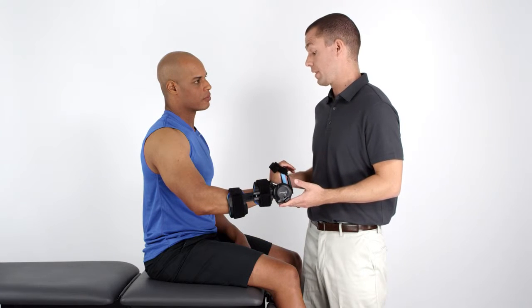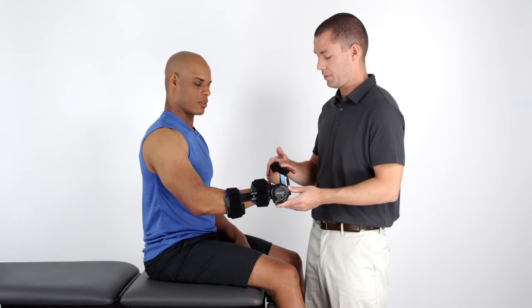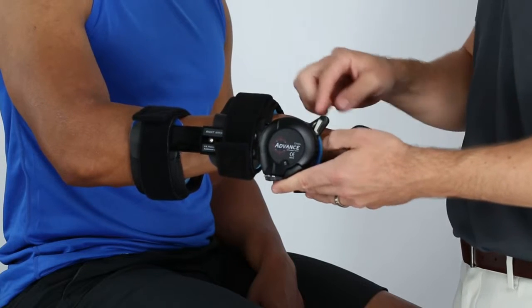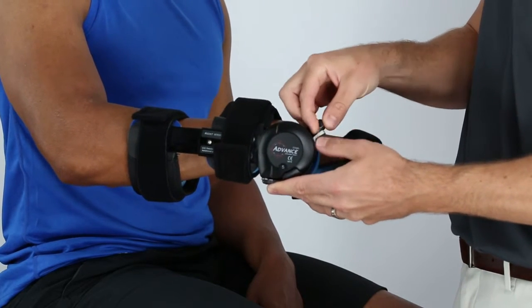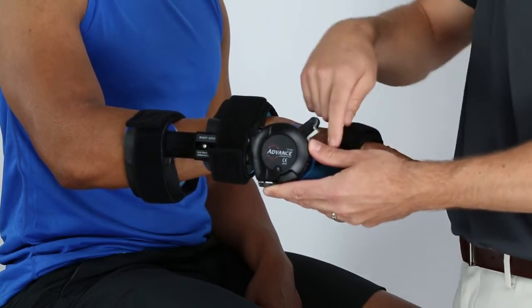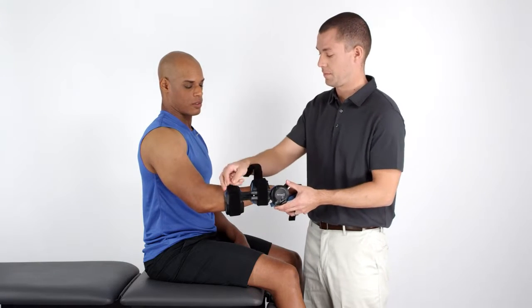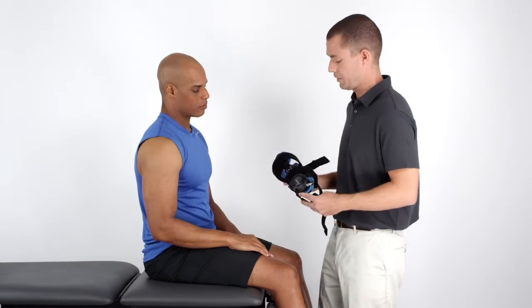Once the patient has reached their wear time limit, remove the advanced wrist orthosis. Lock the device into position at the patient's current end range. Secure the safety. Unfasten or loosen the adjustment straps. Then remove the arm from the device.